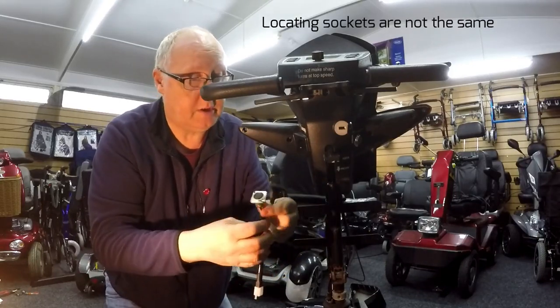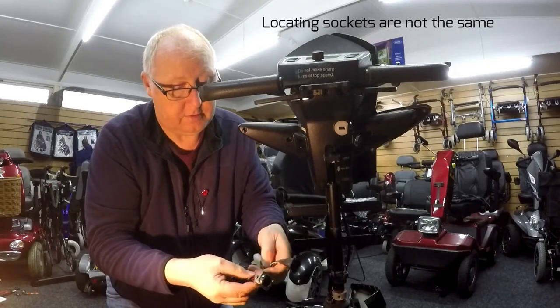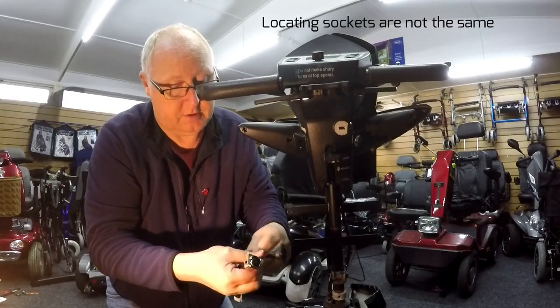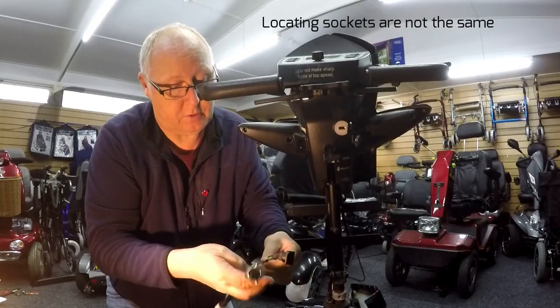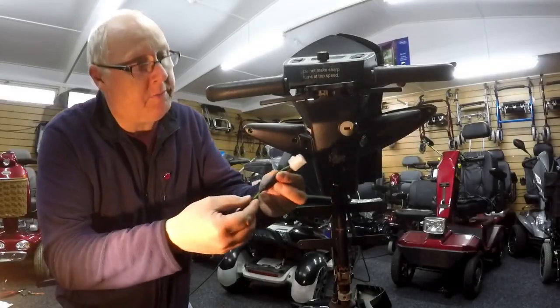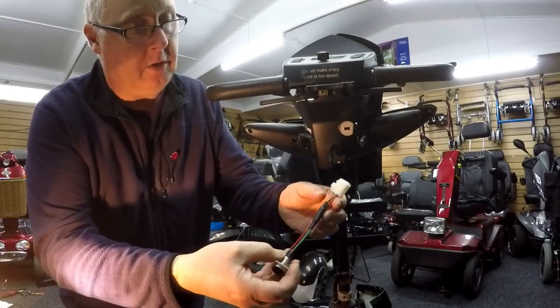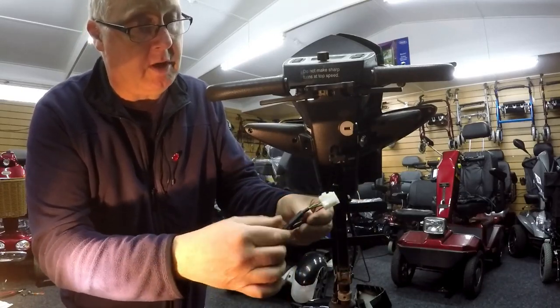So now what I need to do is replace this, so cut and join these so it fits together with its own loom. I will do that now. I've cut and joined the connections back up again with heat shrink.